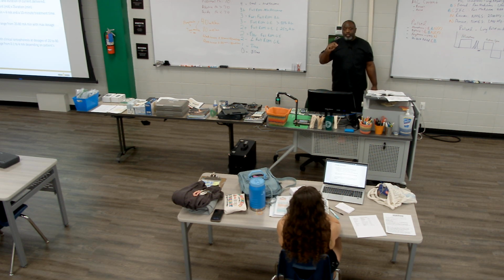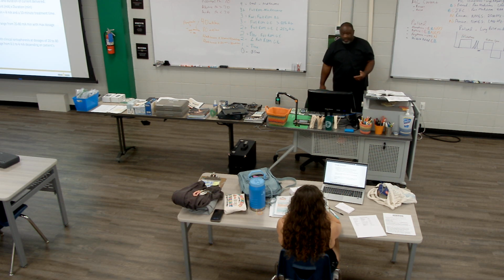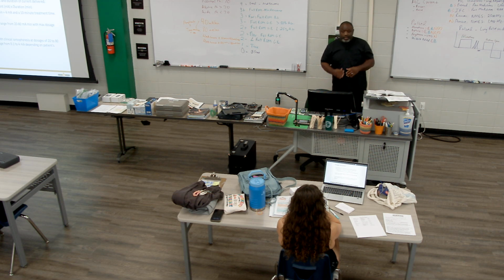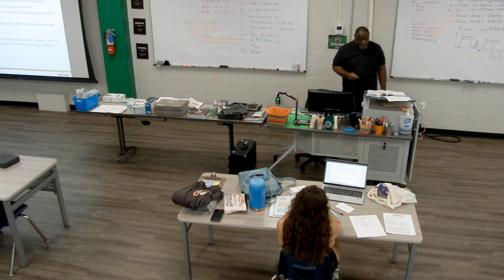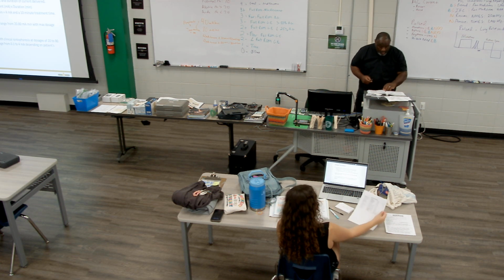You set the milliamps. The current starts to increase from 0 slowly, and then once it hits that peak, it's going to stay there. And you're talking to your patient the entire time. Hey, how does this feel? Is this uncomfortable? Is it really bad? If they're saying it's really bad, turn it down. If they say it's fine, leave it where it is. So the patient will determine the truth of what they're going to feel. Okay? Alrighty.